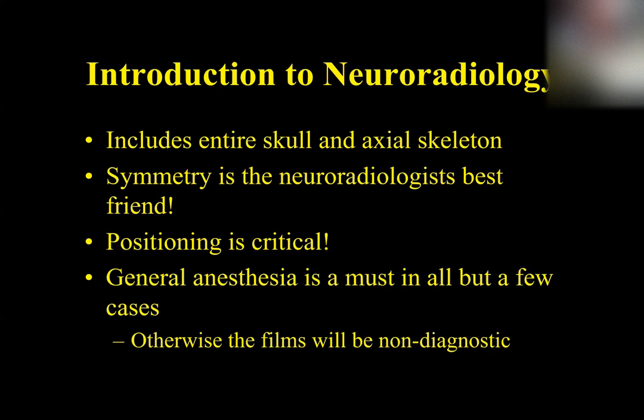Because you're not really getting the X-rays. It's semantics, but in reality, that's true. So a film that we're going to look at through all of this is really a radiograph and not an X-ray. Got it?